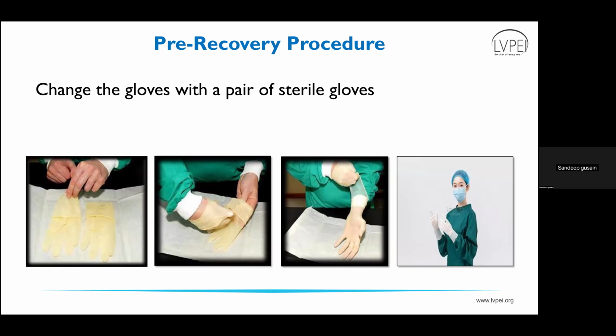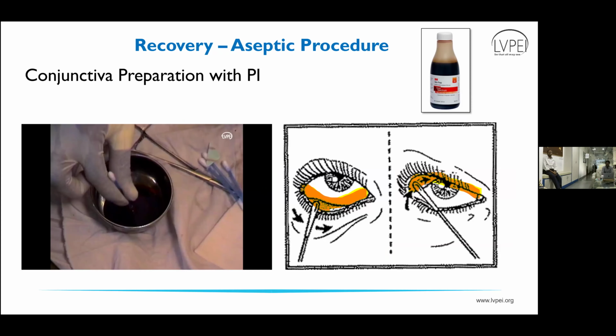Then we have to change the gloves, because the gloves we have used are contaminated while doing this facial cleaning and saline wash. So we have to change our gloves using another pair of sterile gloves. We have to start the aseptic procedure.